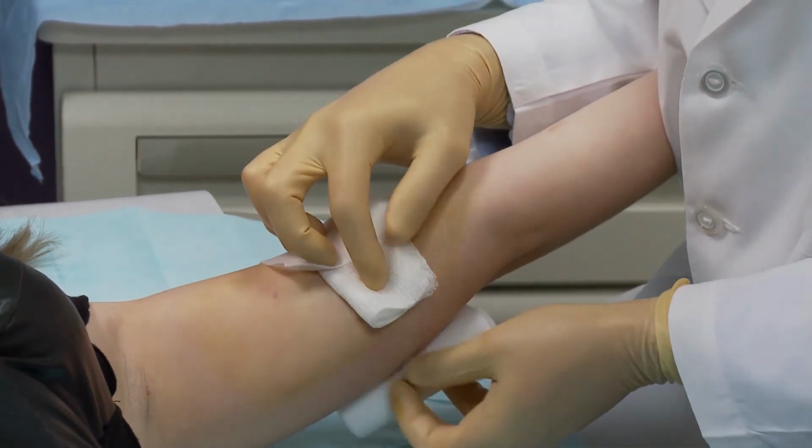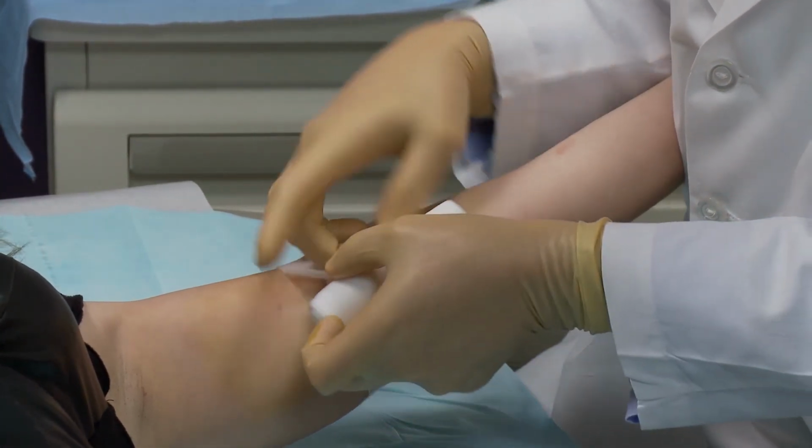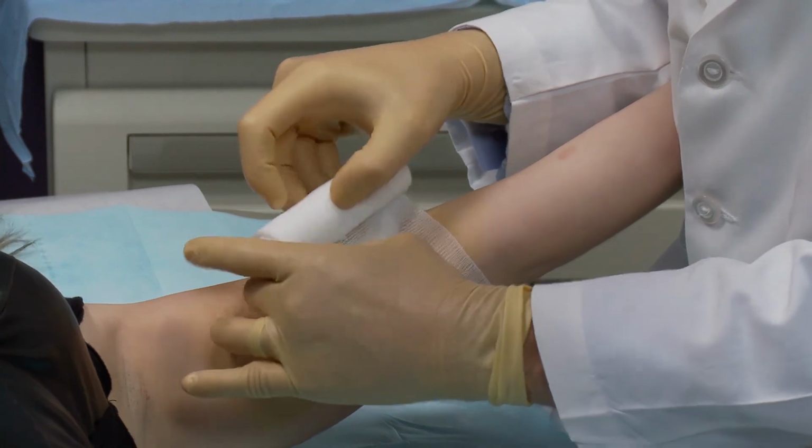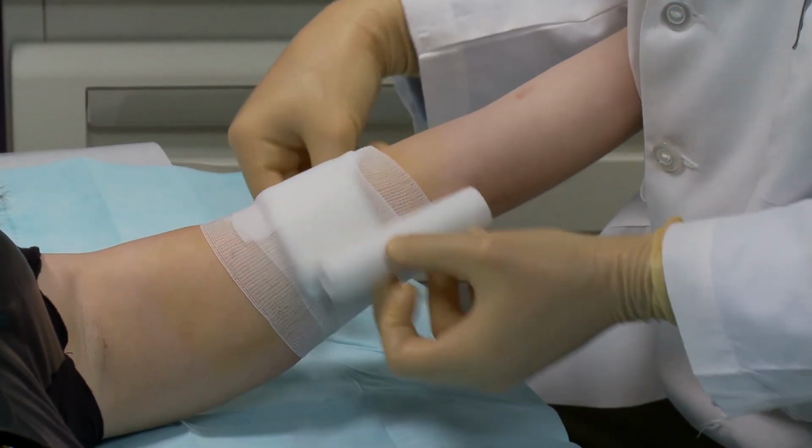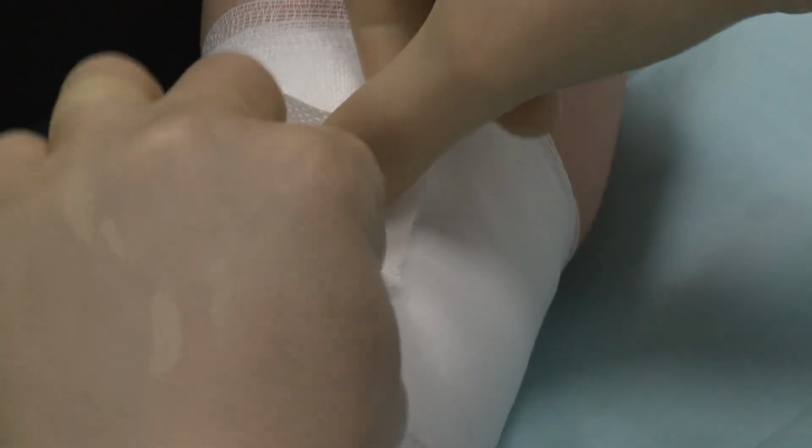Apply a pressure bandage with sterile gauze to minimize bruising. The woman may remove the pressure bandage after 24 hours. The adhesive bandage covering the insertion site may be removed after 3 to 5 days.